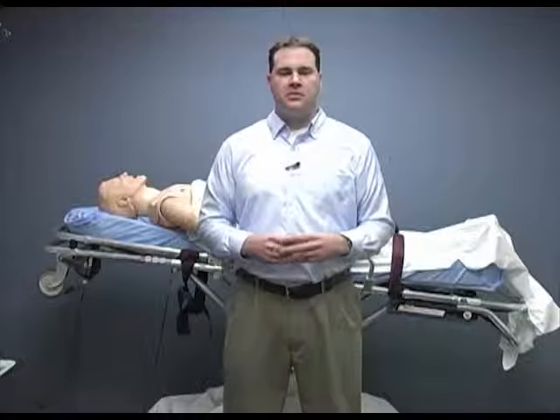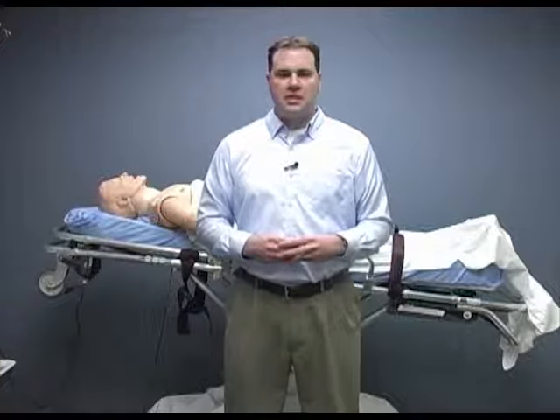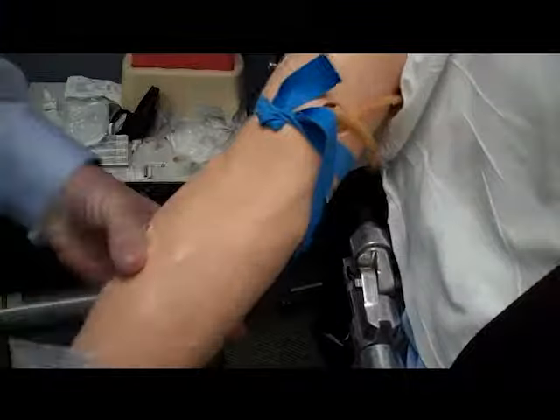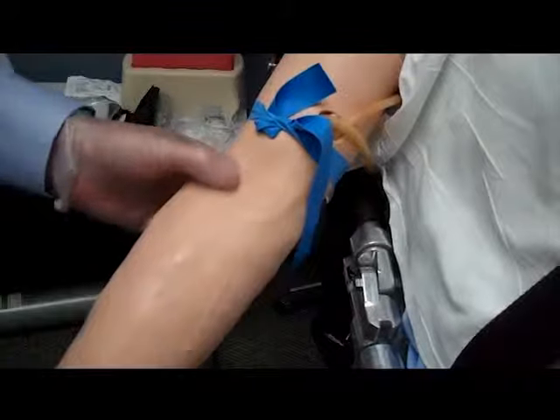We're now going to prepare for the actual venipuncture. First I'm going to locate a suitable site for the IV. The most common sites we use in EMS are the antecubital, the back of the hand, and the wrist. We want to make sure the site does not have any bruising or scarring and has the proper vein size. Now I'm going to clean the site with the alcohol prep, rubbing in a circular motion from the center out.